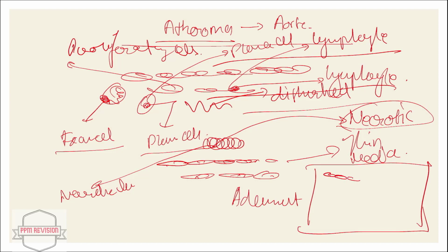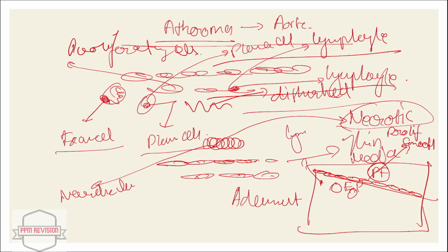So we have seen this. What is this? Okay, something is going down diagonal. So what is this thing going diagonal? So this is atheroma. This is nothing but the proliferating smooth muscle. Yes, smooth muscle, right? So what did I just draw in the starting? Diagonally, this is nothing but the proliferating smooth muscle. So looking at the cells, I told you there are dash cells, dash cell and dash cell. It's nothing but the foam and plasma cell, PF. Foam and plasma cell, right? So it is easier to memorize. And you can also add some lymphocytes as well. So lymphocytes can also be present.